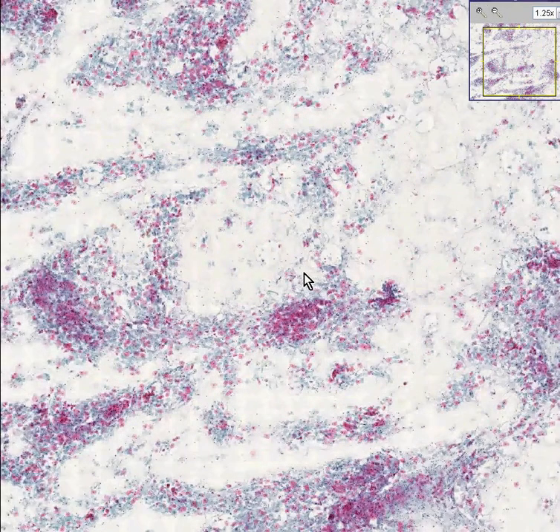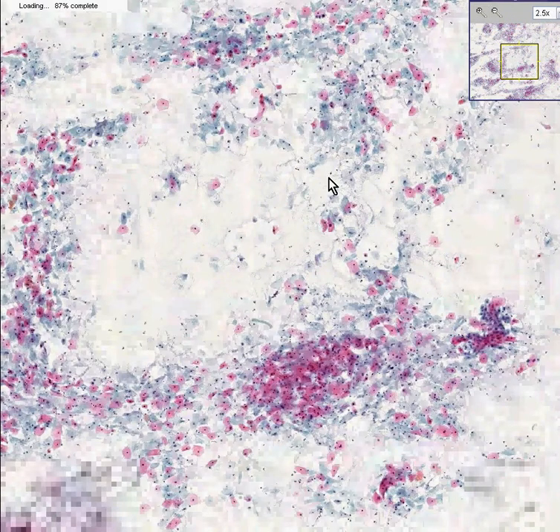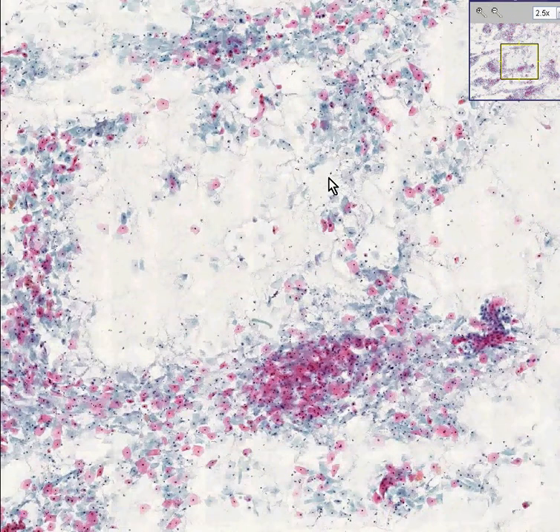Okay, now we are going to give a very quick crash course in cytology, cytopathology. Notice that you can't tell what organ this is because it is not a section of anything. What it is, is a bunch of epithelial cells which have been smeared from an epithelial surface and stained with a stain that is similar to H&E but a little bit different.